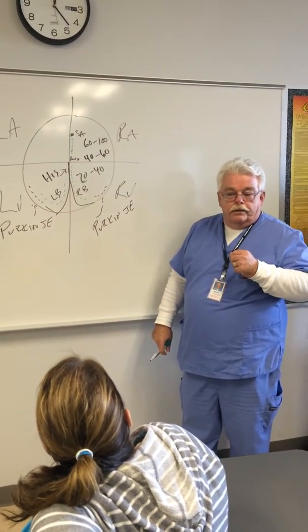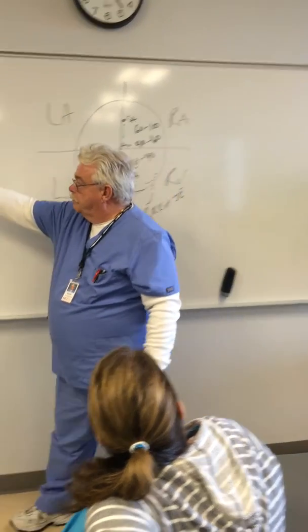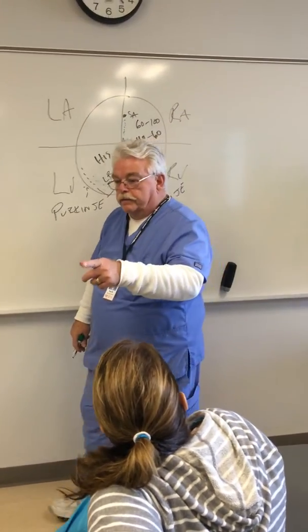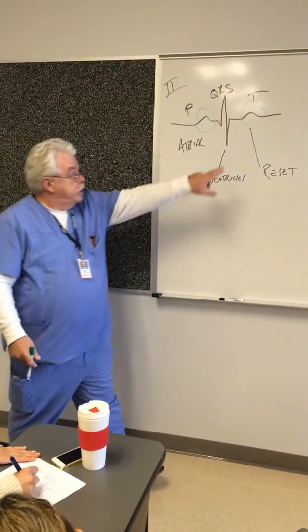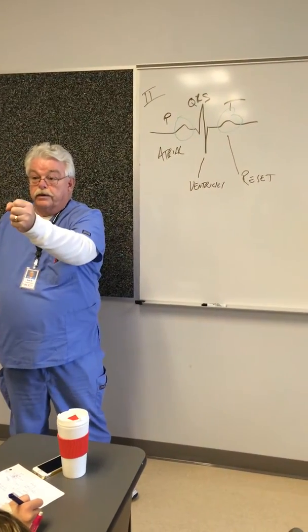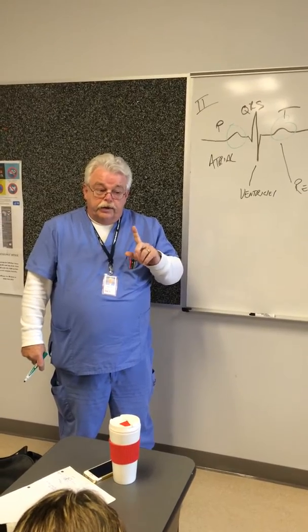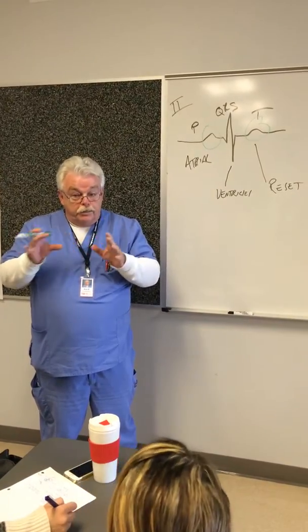Critical thinking. Is it the radial? Yeah, you can feel a radial pulse, but what beat on a radial pulse is represented here? QRS, right. You can't feel atria contracting down here. You can't feel the reset down here, but the QRS indicates a ventricular squeeze, and that's what's causing it. Not what you hear, don't confuse that. S1 and S2 is caused by valves opening and closing. That's why you hear lub dub, right?